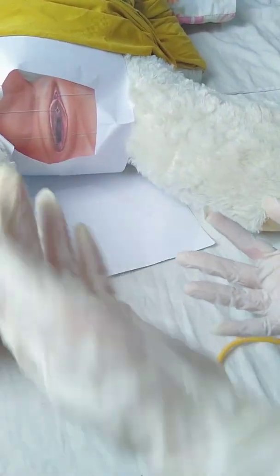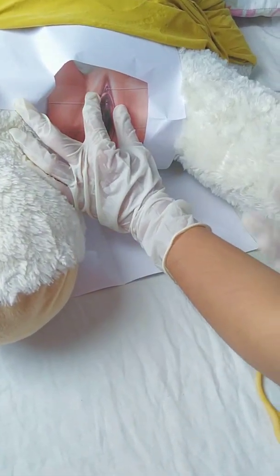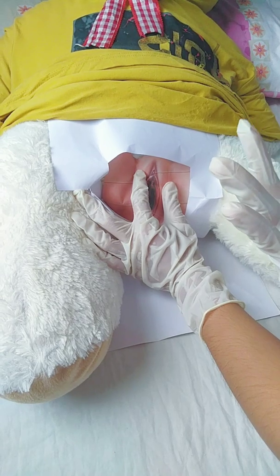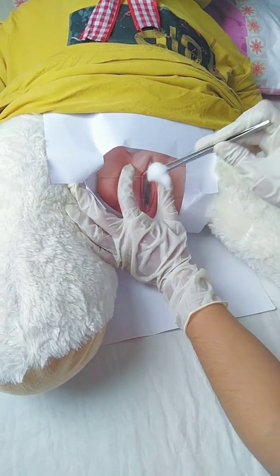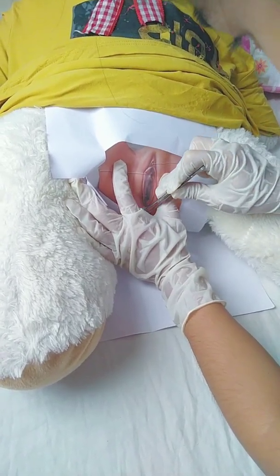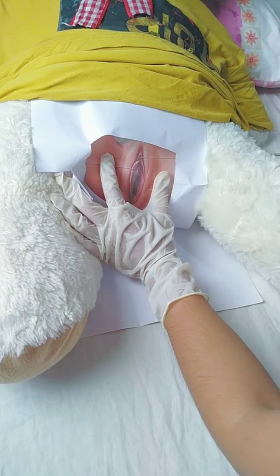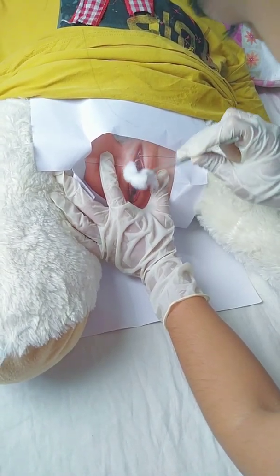With the non-dominant hand, identify the meatus by retracting the labia, and then hold this position throughout the procedure. With the sterile dominant hand, clean the meatus with the antiseptic solution, moving from top to bottom, and first do the farthest from you. Then clean the middle.